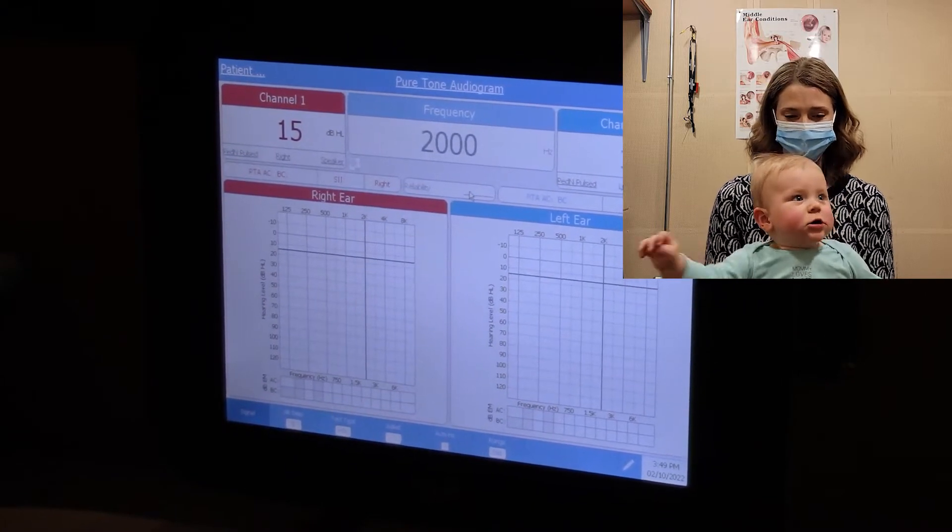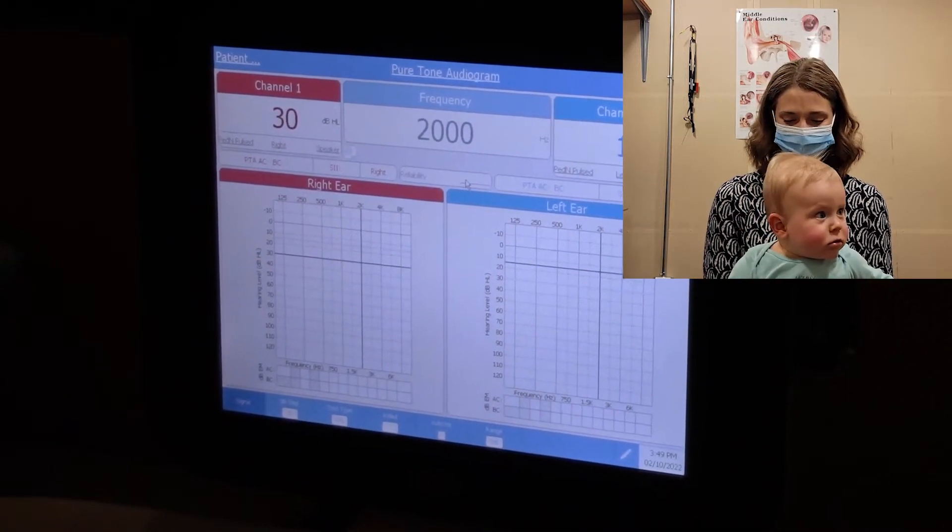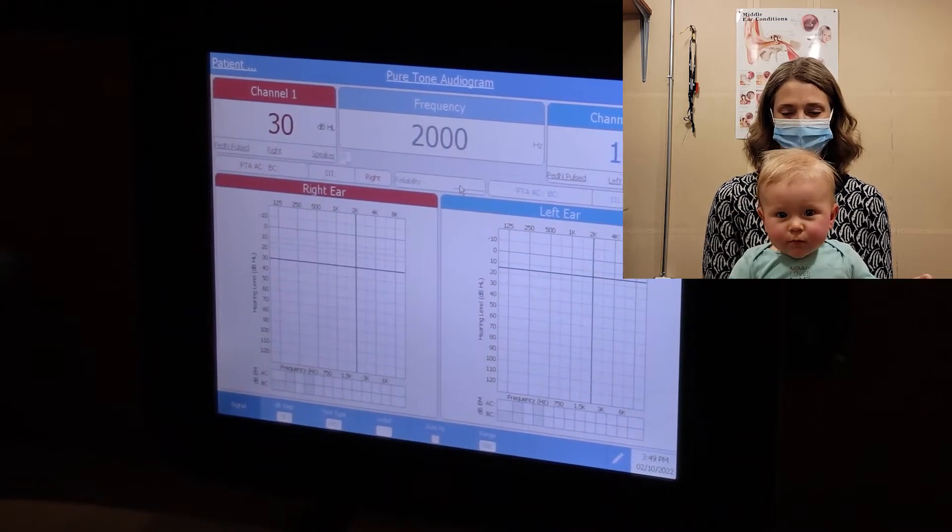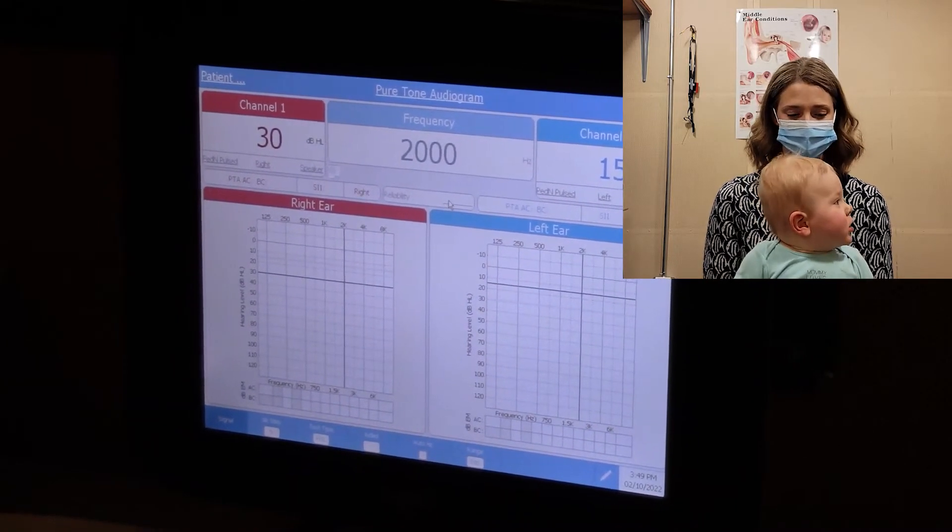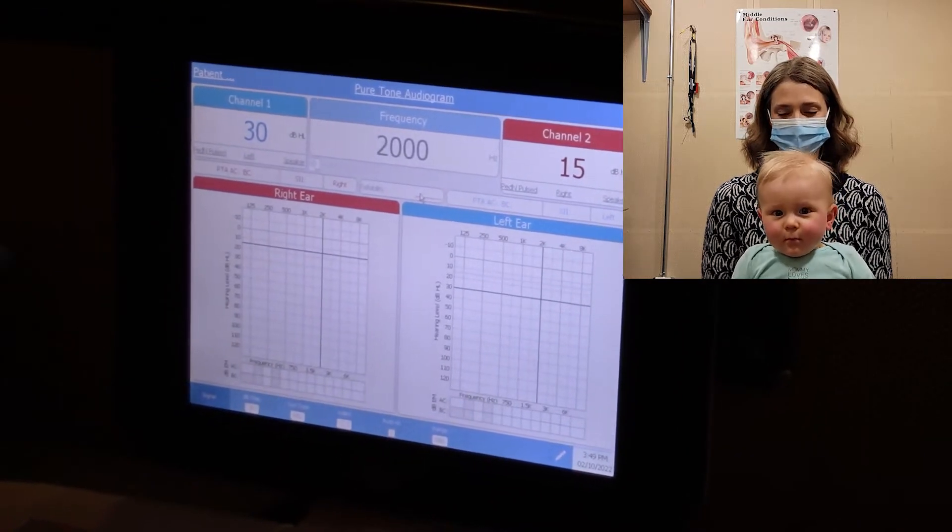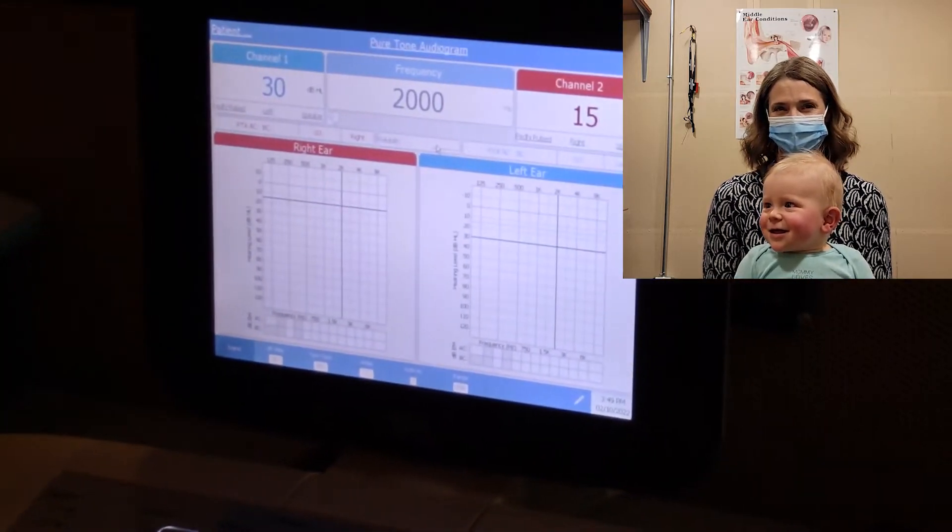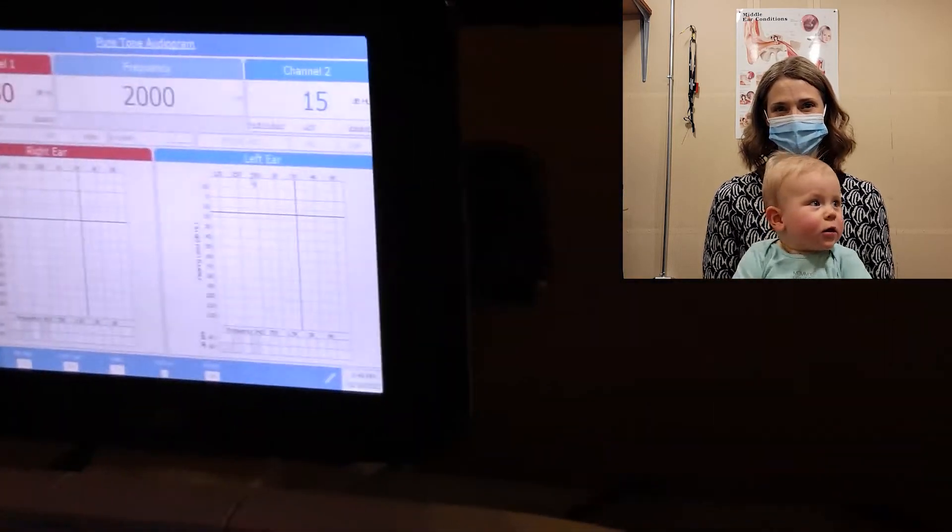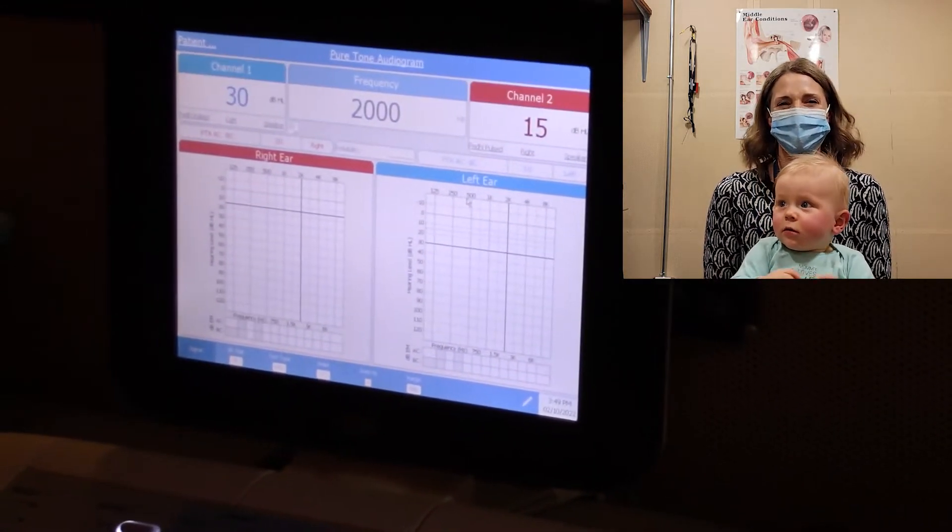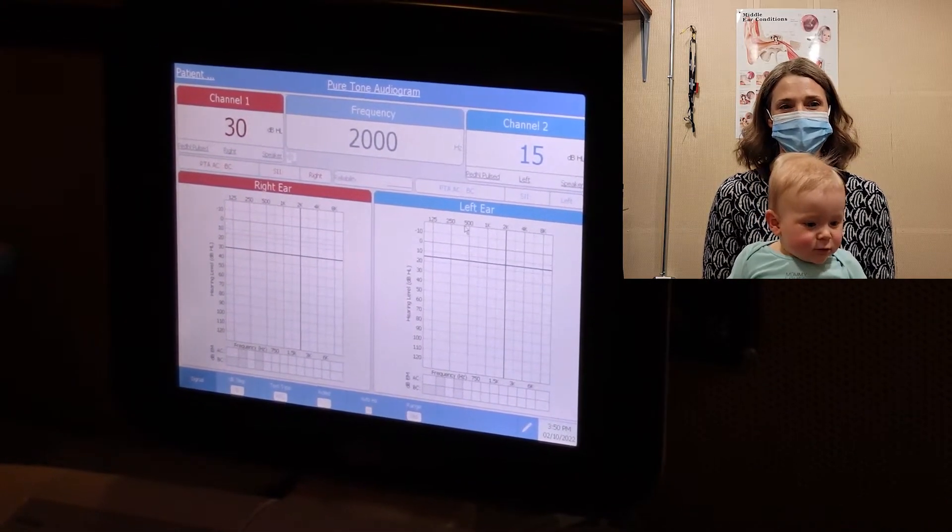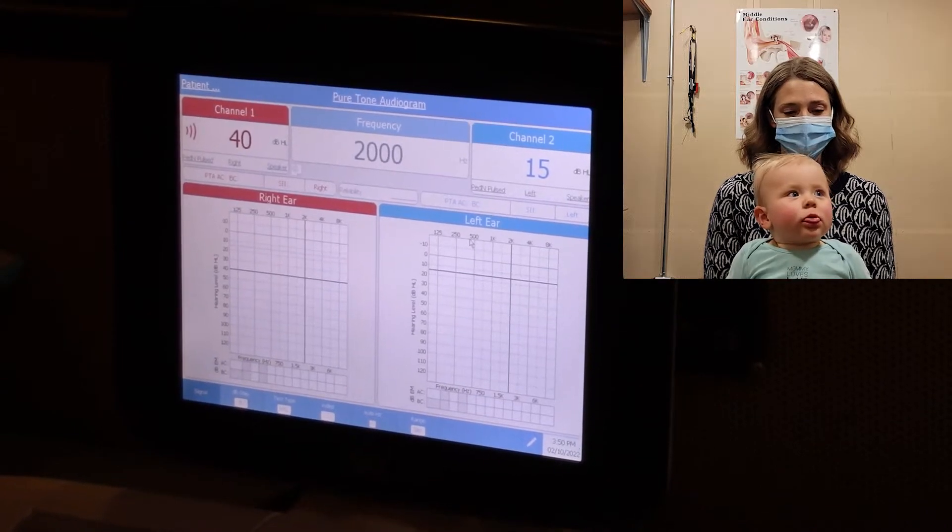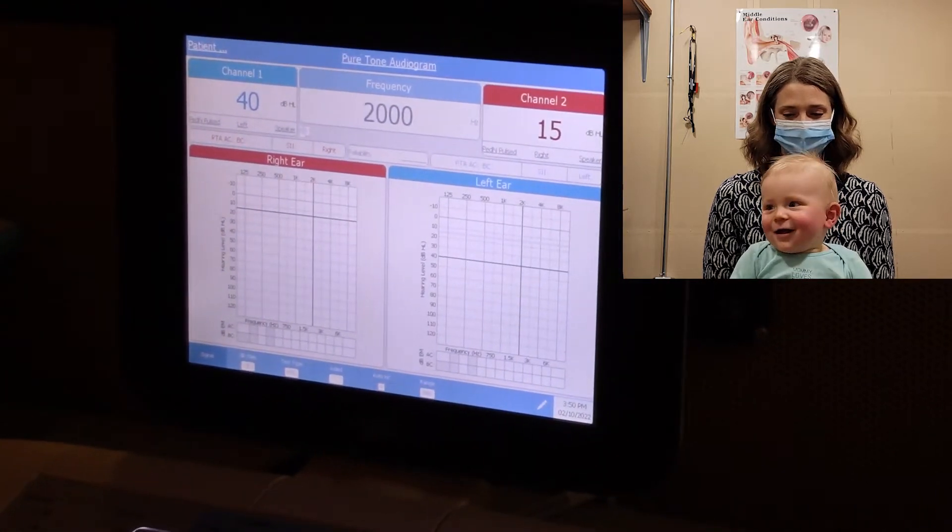And I'm going to go, we got them at 10, I'm going to go up to 30. So we've got a peds noise, pulsed. And we're going to pick a speaker. Let's go our right. No, we're going to go our left. Because he's reading my mind again. And I'm presenting. He turned that way. He didn't look directly at it. I'm going to go right to our right. I'm going to go up to 40. I'm going to go ahead and condition him again. Because he's not really carrying it over.